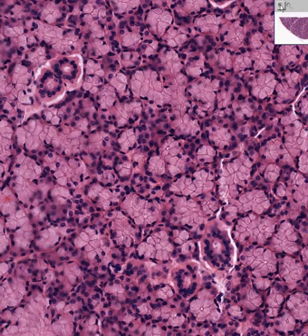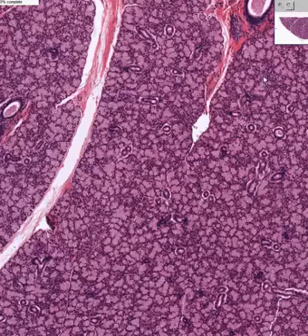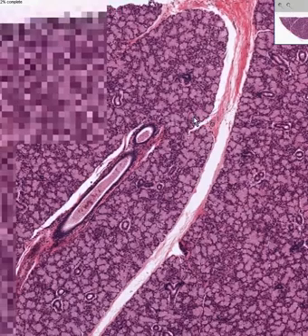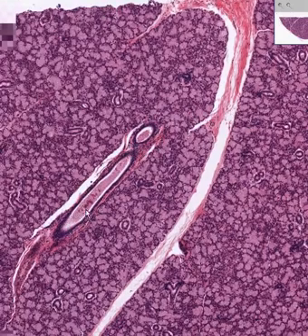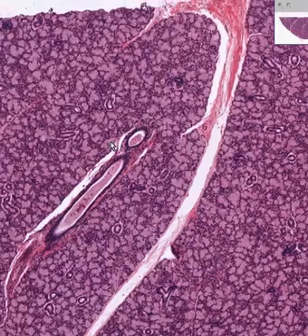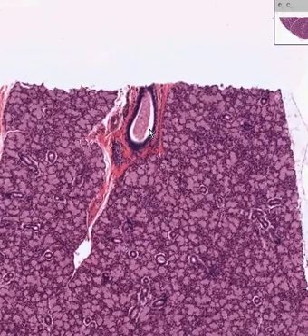All of these are intralobular ducts. We try to differentiate between the striated intralobular ducts and the intercalated intralobular ducts, but it really doesn't matter much clinically. But we can also see some interlobular ducts or larger ducts, which are clearly within the fibrous tissue septae between the lobules. And if you just look, you could probably figure out what kind of epithelium it is.